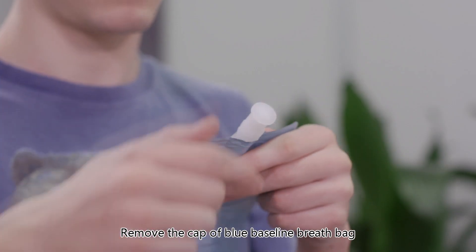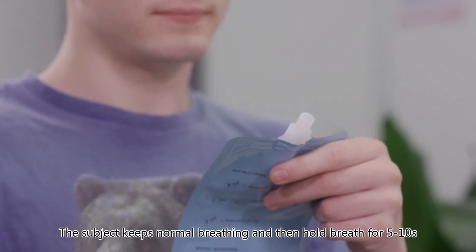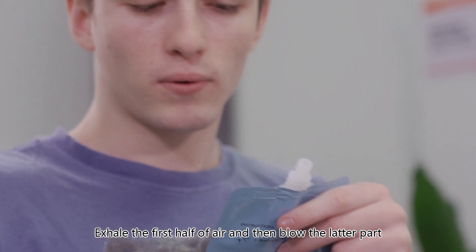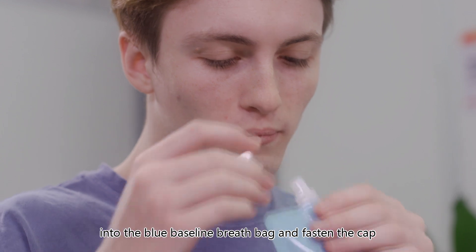Remove the cap of the blue baseline breath bag. The subject keeps normal breathing, then holds their breath for five to ten seconds, exhales the first half of air, and then blows the latter part into the blue baseline breath bag. Fasten the cap.